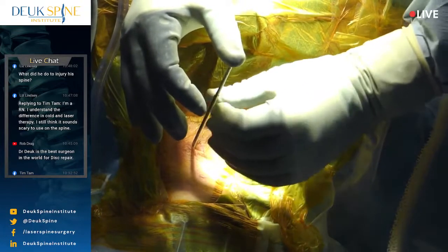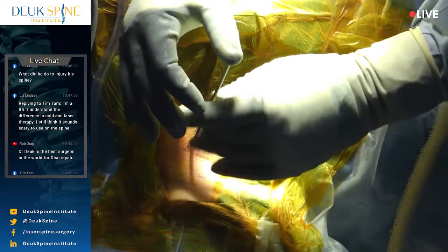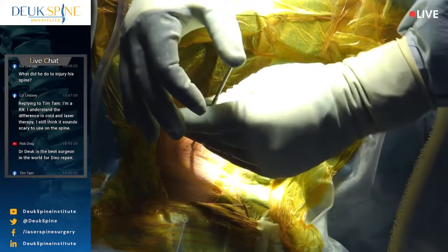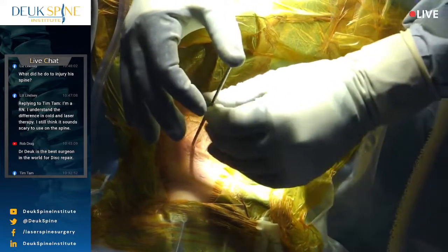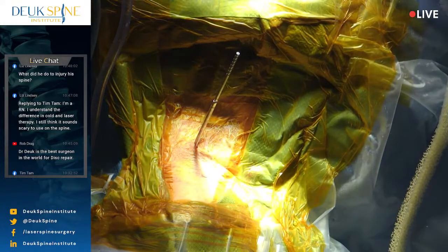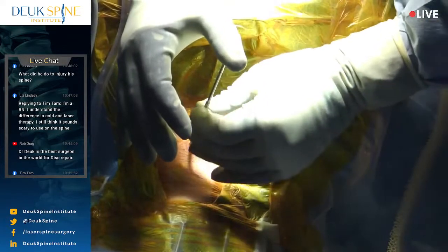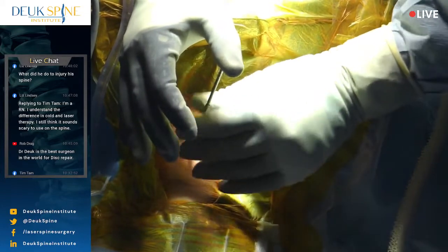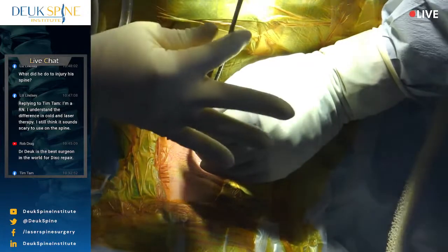It's a very thin tube, but it doesn't expect to have much pressure. So it just needs to retract the tissues. It's about 20 millimeters of mercury. And of course, tubular designs transmit forces nicely. I use a twisting method to free it up from soft tissues. I could probably just jam it in there, but I don't want to grab a vein and rip it. So by twisting, you kind of free the outer wall of the tube away from soft tissues.